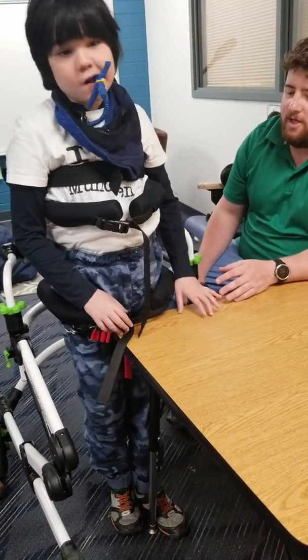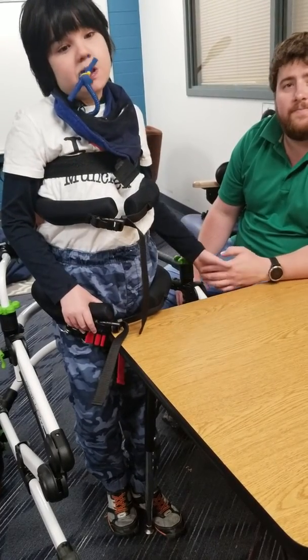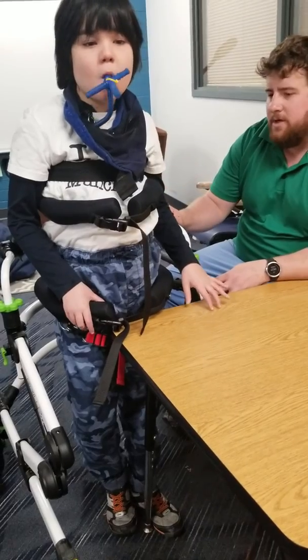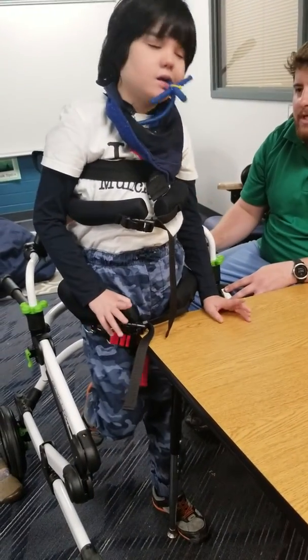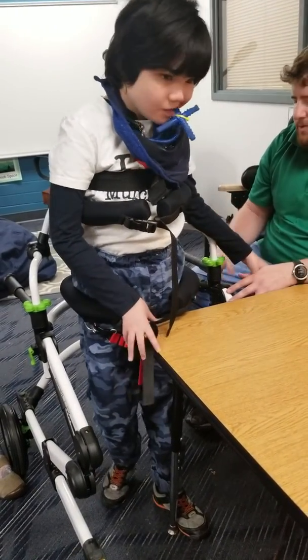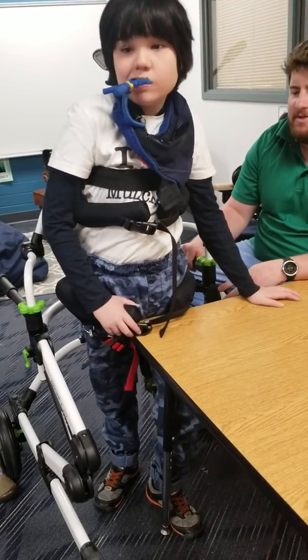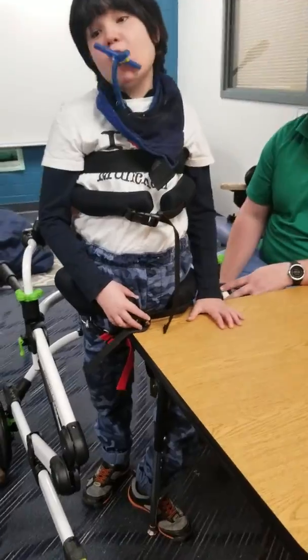Super strong. So, when or if do you guys use the pommel? So, if we're stationary like this, when we're up to the table, if we notice it's an especially tired day, we can just put it up right now. Lately, since we've only been doing about 5 minutes, we haven't been using the pommel as much. But if we were going to do it in a sustained thing, was there something you pulled to push it up? Yes, there's a little lever right here.